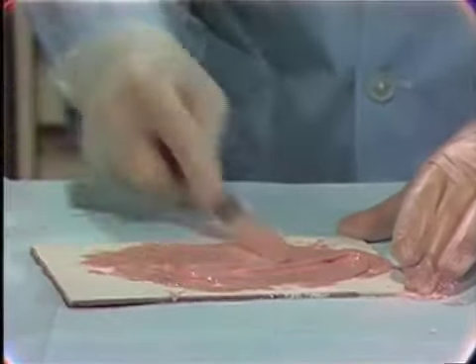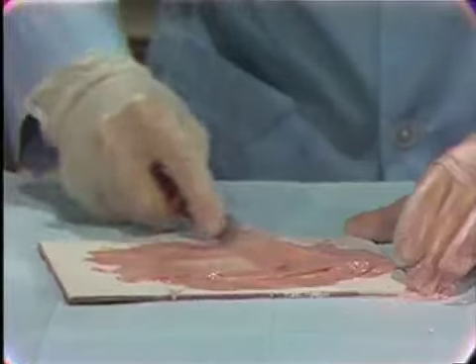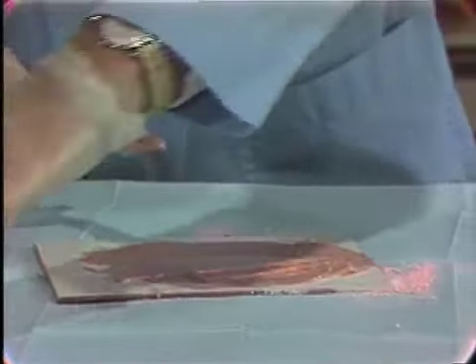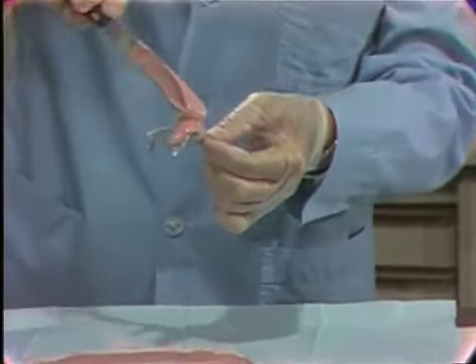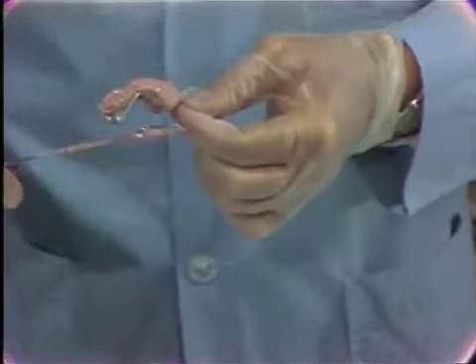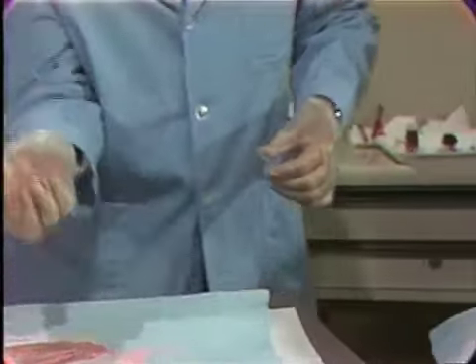When you have the mix properly spatulated, you gather up as much as you can, take the tray and load it in one continuous motion all the way around the tray. And then you've got to go to the mouth, get this to the mouth before it all runs out. And in doing that, to keep it in the tray, we would butterfly this over to the mouth, place it in the mouth.